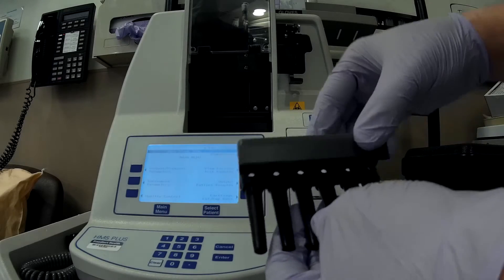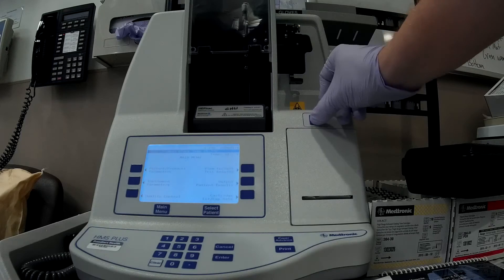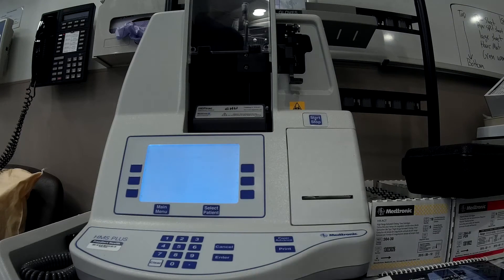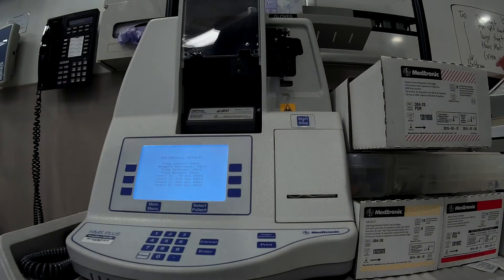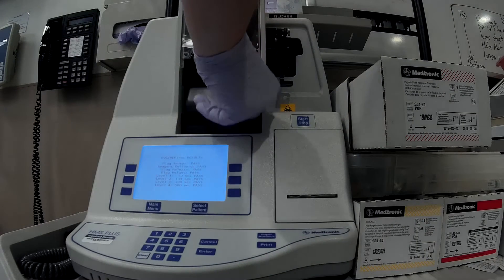Then select the electronic QC cartridge, insert it into the machine, and press start. Let the electronic QC run — this will take several minutes. When it is finished, remove the electronic QC cartridge.